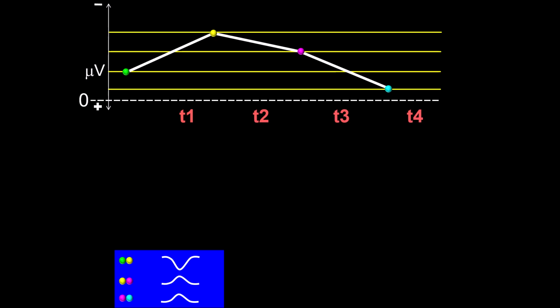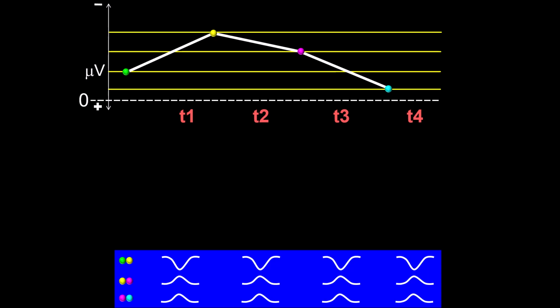Now, I need you to assume that the field recorded at the scalp level is held constant over time. I will express the passage of time by adding the letter T followed by a progressively larger number. As you can see, assuming, as we previously stated, that the scalp field is held constant over time, the bipolar montage recording characteristics will not change.